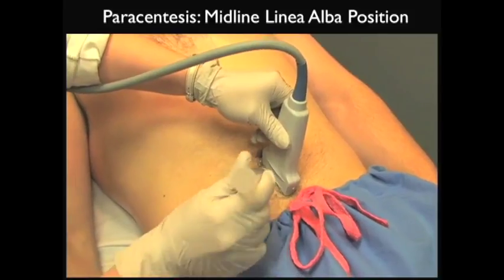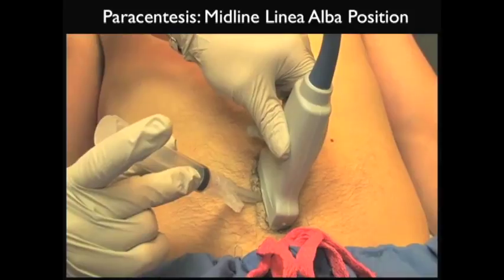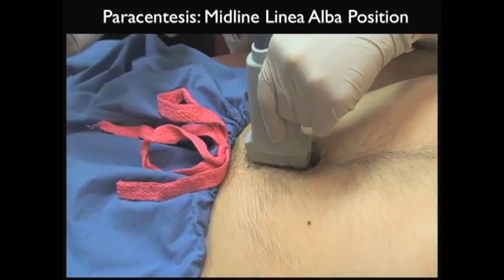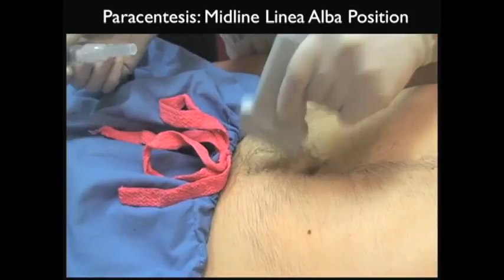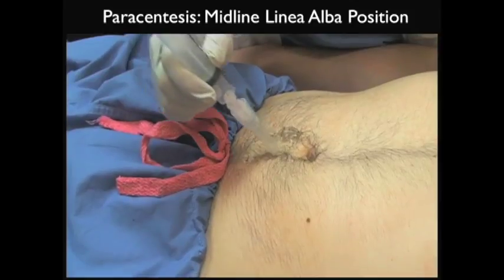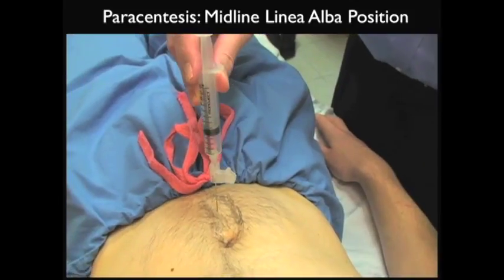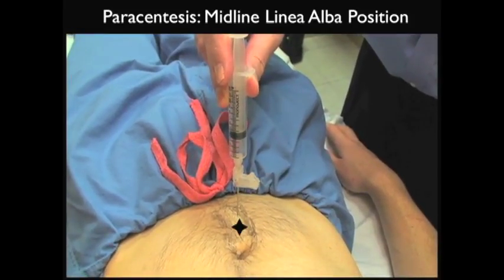Note the high-frequency probe placed along the midline linea alba, and we're coming with a cap needle at a 45-degree angle underneath the probe, looking for the ring-down artifact onto a suitable pocket of ascites. Here's a different viewpoint from the same midline linea alba position. Again, we're placing that probe along the midline, and this would be about the appropriate position for the paracentesis procedure. And here we just place the needle right there, directly inferior to the umbilicus. And I'll indicate that with a black star.